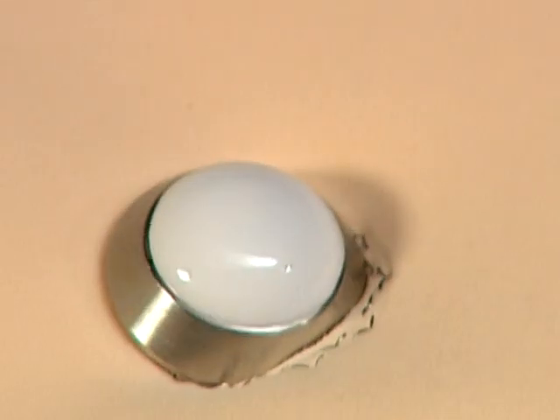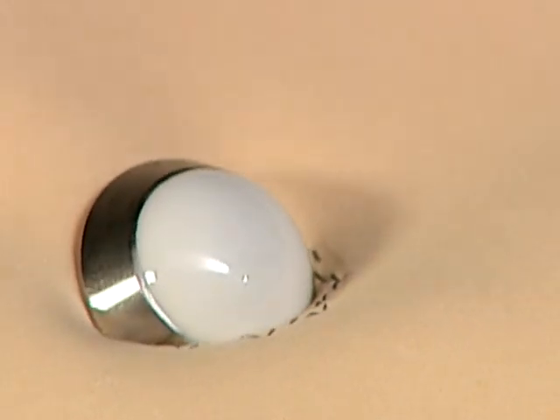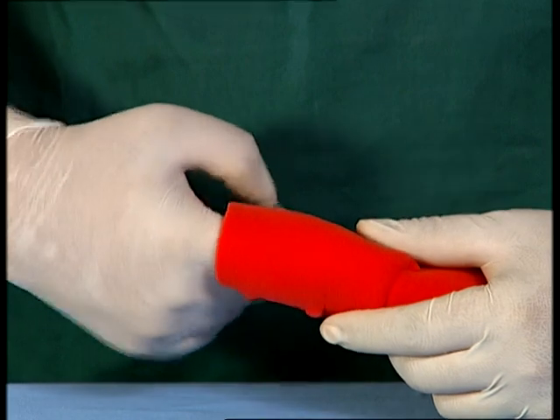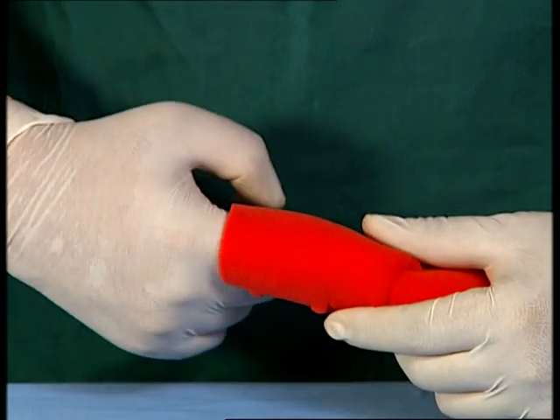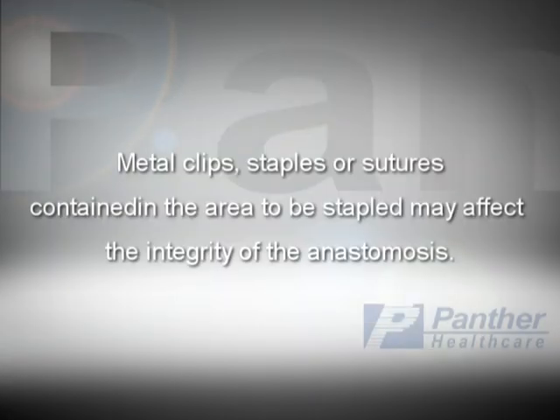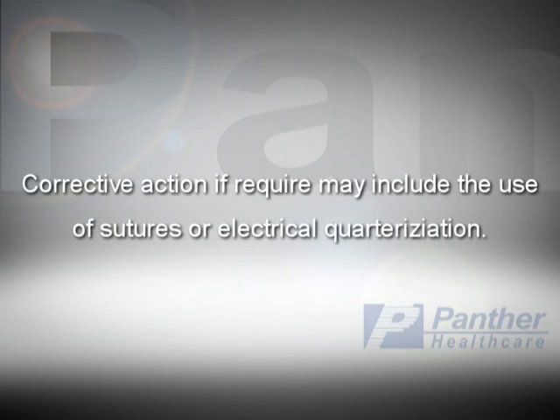Position the tip of the closed instrument at the correct angle relative to the anastomosis to facilitate the process of removal. Always inspect the anastomotic staple line for hemostasis and check the completed anastomosis for integrity and leakage. Metal clips, staples, or sutures contained in the area to be stapled may affect the integrity of the anastomosis. Corrective action, if required, may include the use of sutures or electrical cauterization.